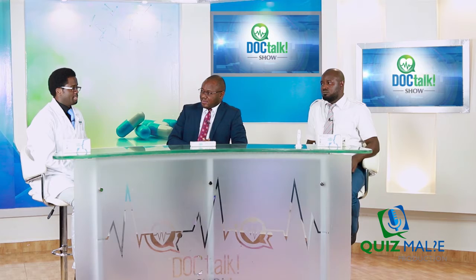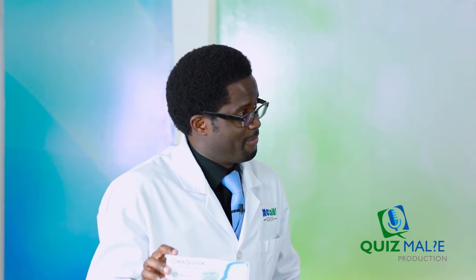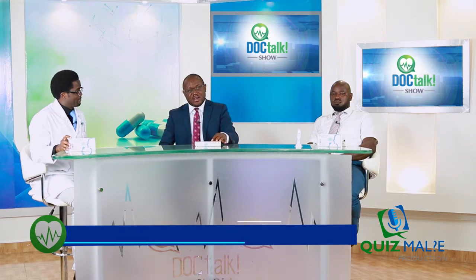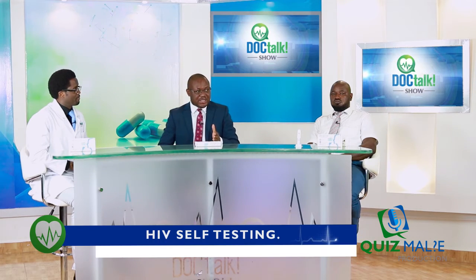If someone tests positive with this kit, it's not the end of the story. They should go to hospital. Exactly. And the insert is very clear. When you test positive, you go for a confirmatory test. If you test negative, then we encourage you to retest after 3 months if you've been exposed. Some people may test negative and they have no exposure whatsoever, so they may not require to retest. If you're positive, you come for a confirmatory test at the nearest health facility, of your choice.